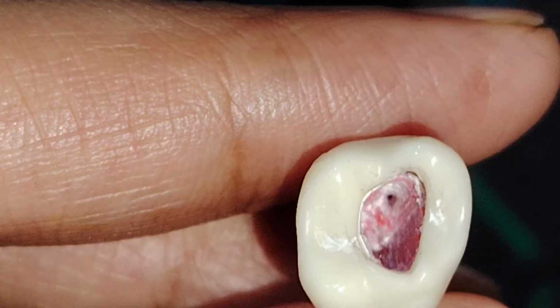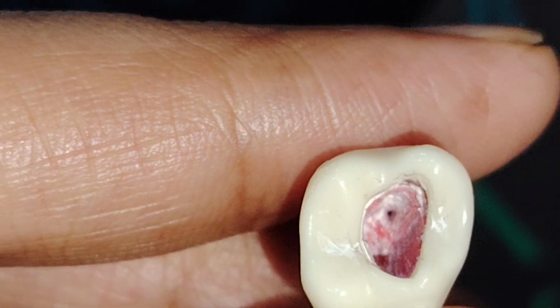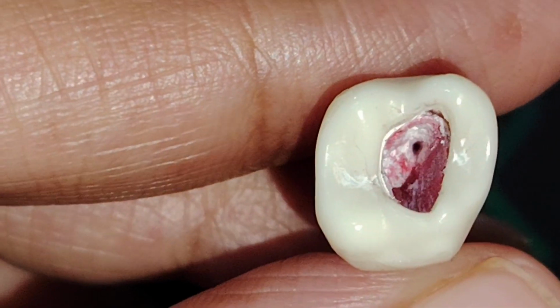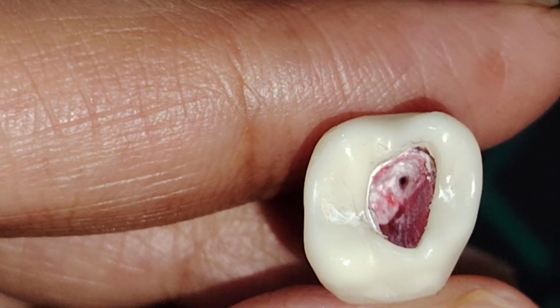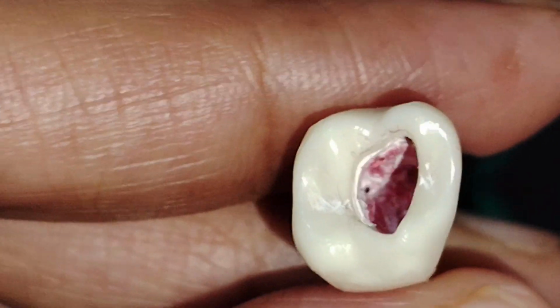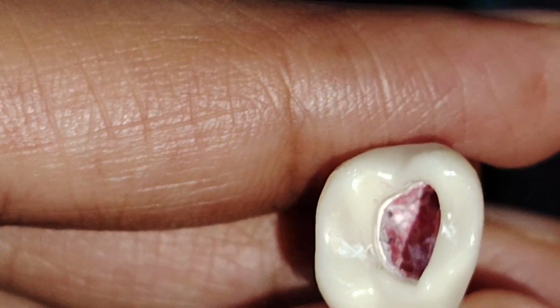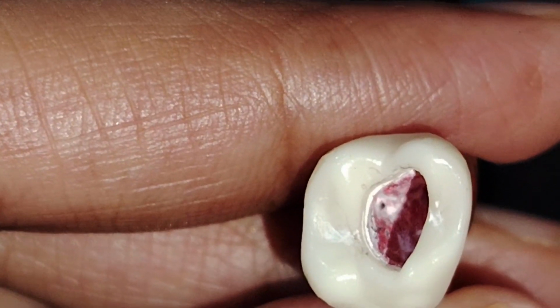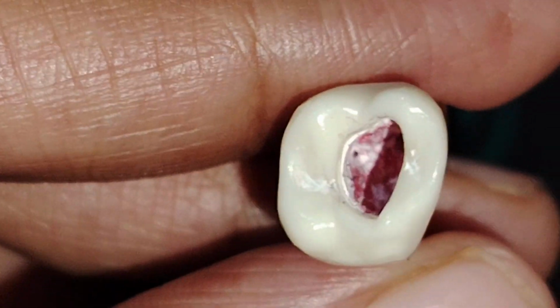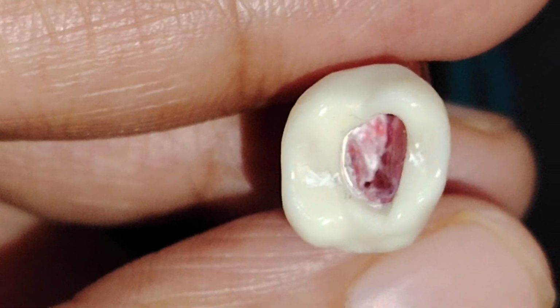This model has one mesiobuccal canal. You can see the orifice, the one I'm pointing to, the black hole, that is actually the canal orifice. Then you can see the distobuccal canal orifice, and you can also appreciate the palatal orifice.